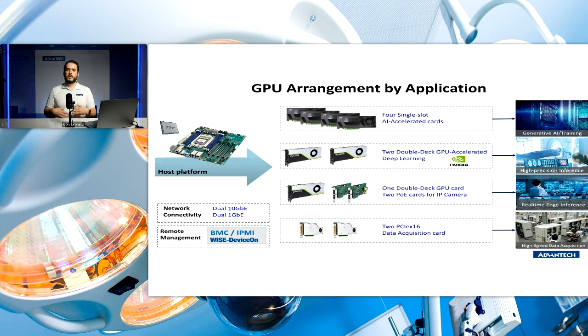And then, of course, for more basic applications, some of these systems do have GPUs on board with the CPU, for some of the more workstation and consumer-based systems. In those cases, you can just use your PCI Express or your expansion to add data acquisition modules. So if you're working with something that's a little bit lower bandwidth, or even in test and measurement or with diagnostics in a medical environment, you might need a lot of low bandwidth inputs into the CPU. That's where you'd use that.